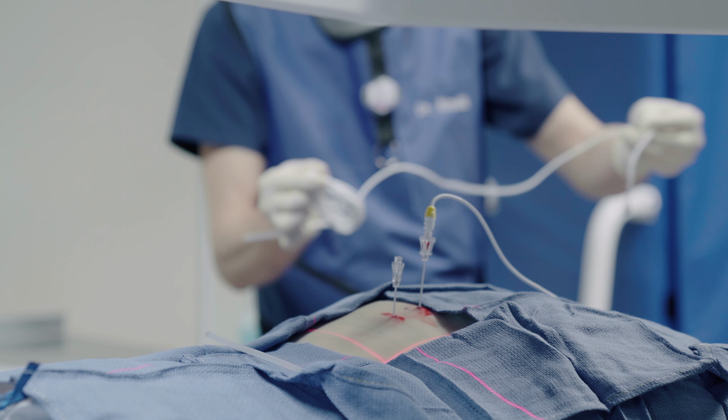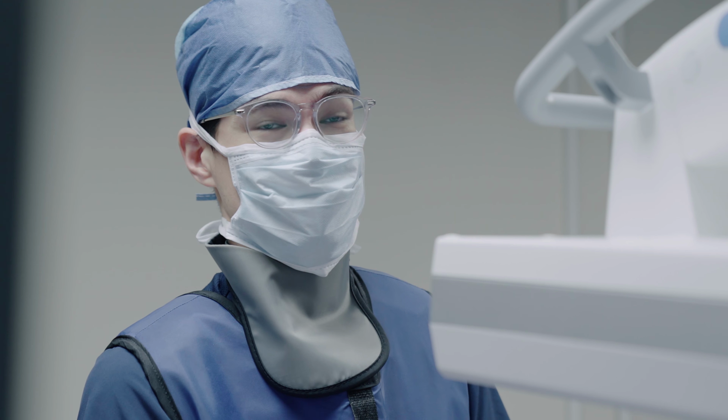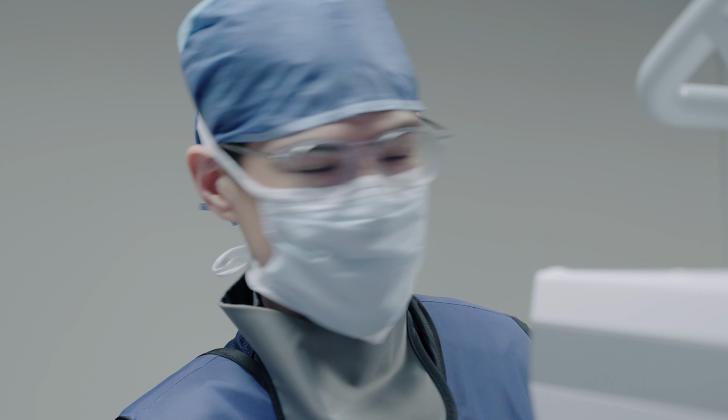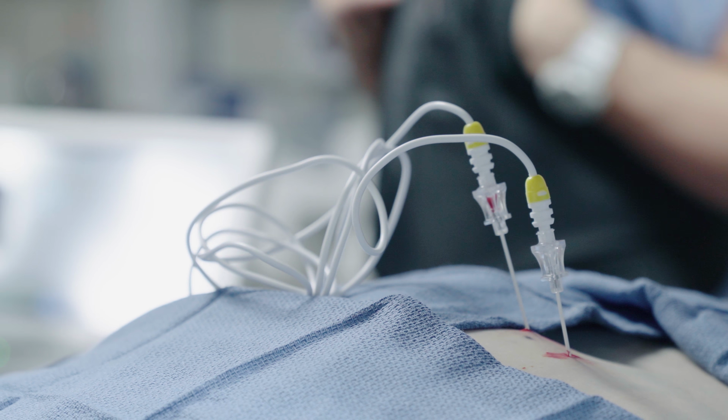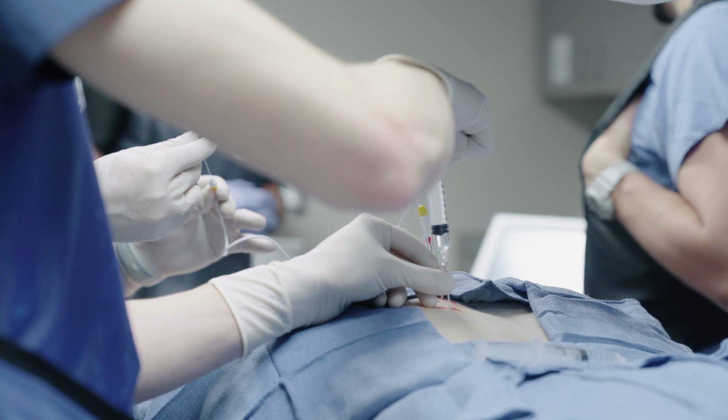Electrodes in, probes, and we're first going to do tests to make sure that there's no nerves that will be damaged that would cause any motor deficits. Obviously, we only want to change the sensory, we don't want to change the motor. The freezing going in now, you might feel some pressure here.